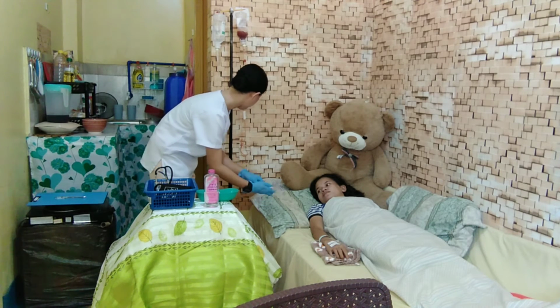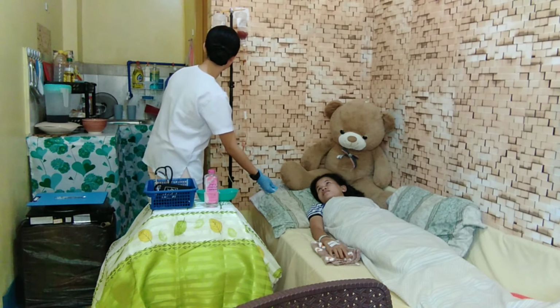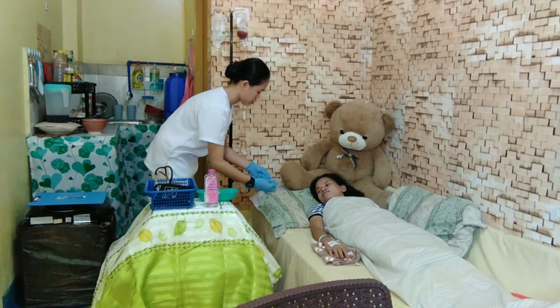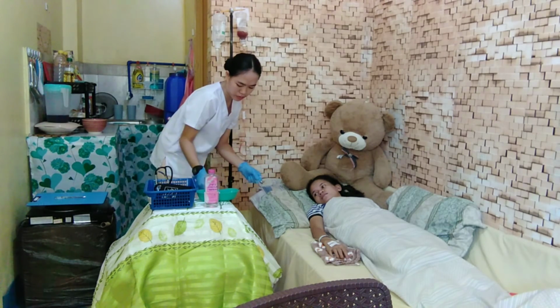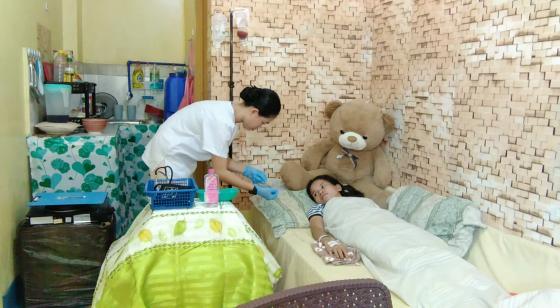I will first close the clamp on the IV set solution of 0.9% PNS before attaching the blood. So I will now insert the needle.